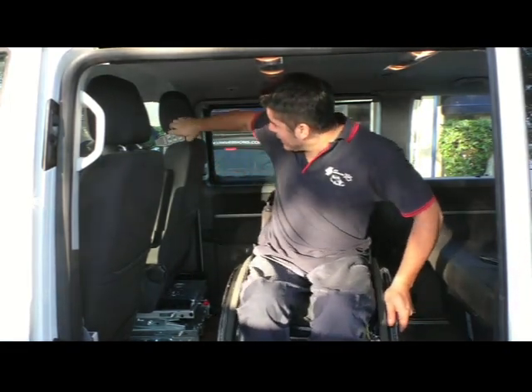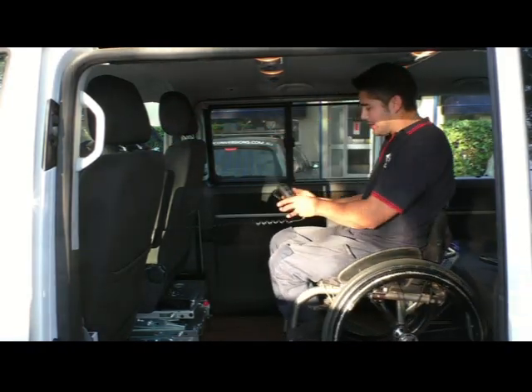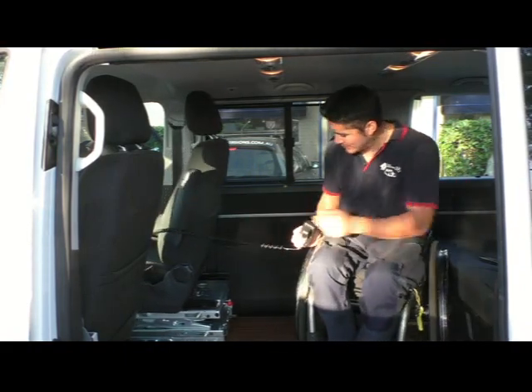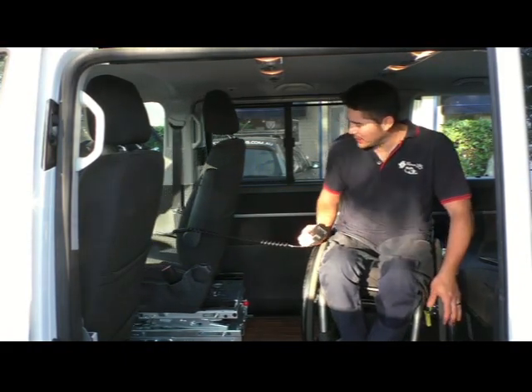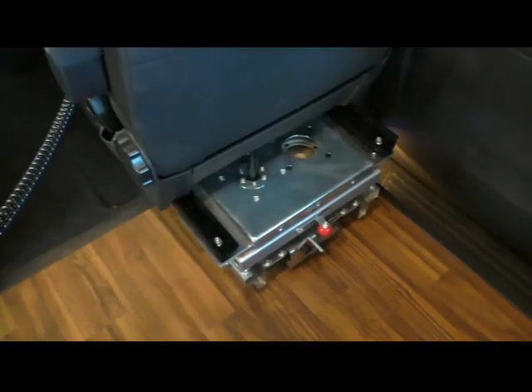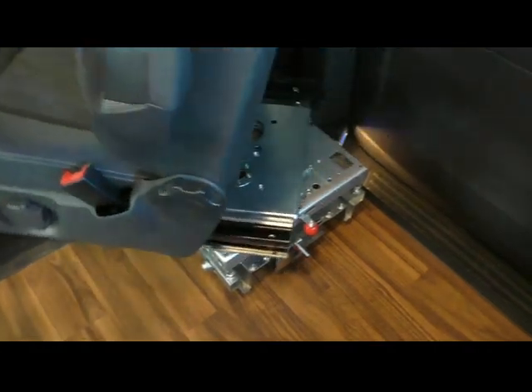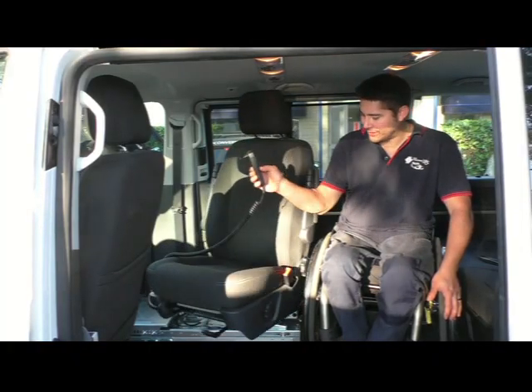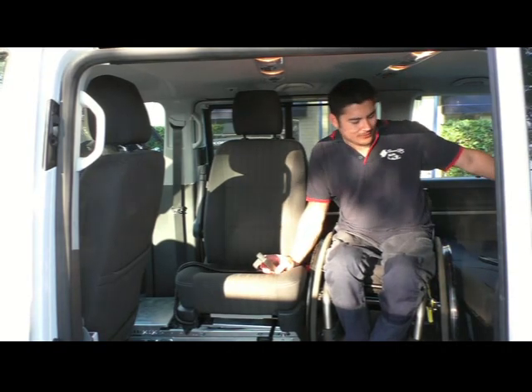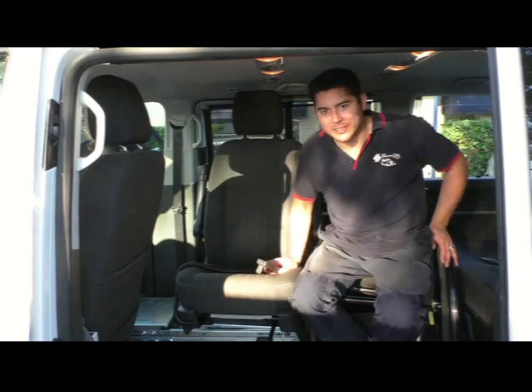It's all telescopic, so when you see it retract you'll understand what I mean. It comes out on its own rails — it's all self-supported. You've got six different axes of movement. So it comes all the way back and then we can rotate it right around. It will actually do a full 180 degrees, so you can sit facing the passengers in the back seat if you want — have a little picnic or a meeting.